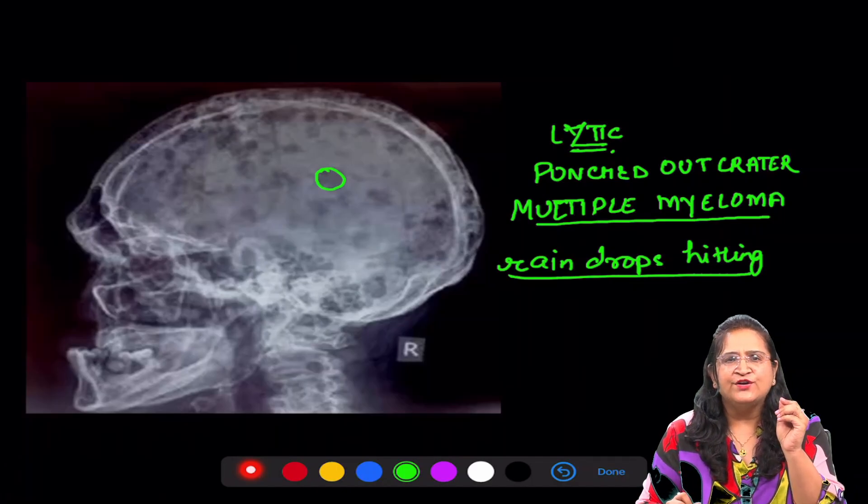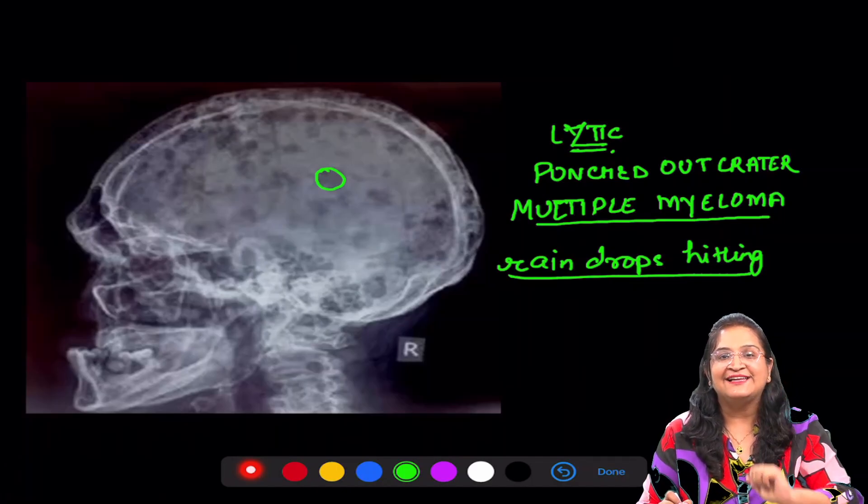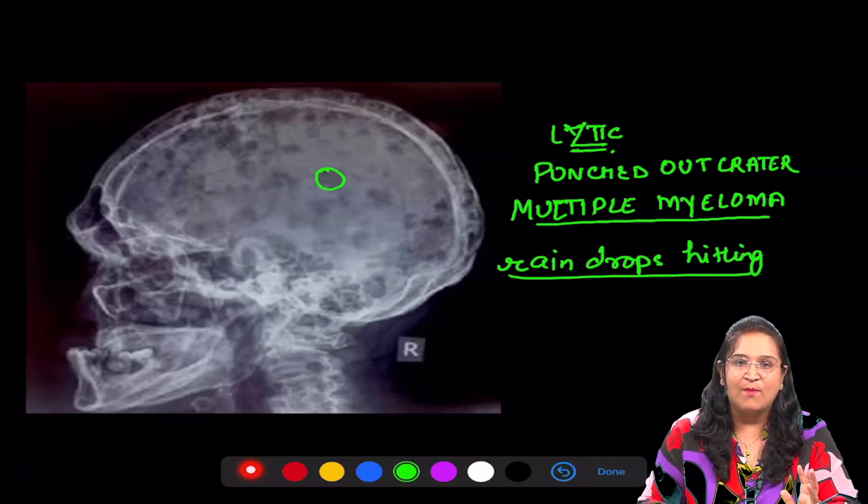Yes everyone, very important radiograph — punched-out crater-like lesions: multiple myeloma.